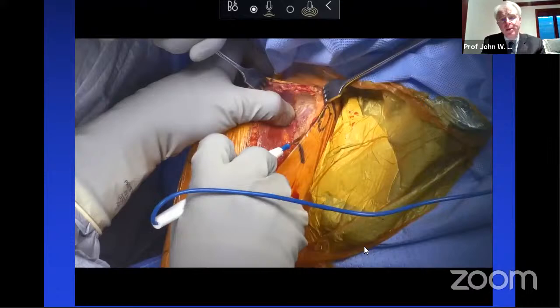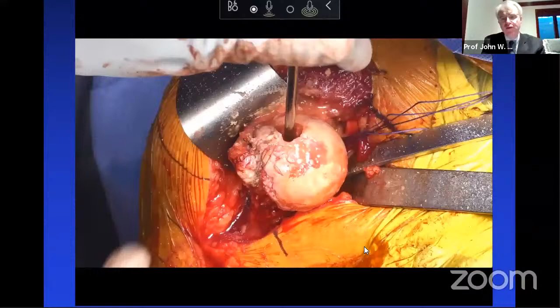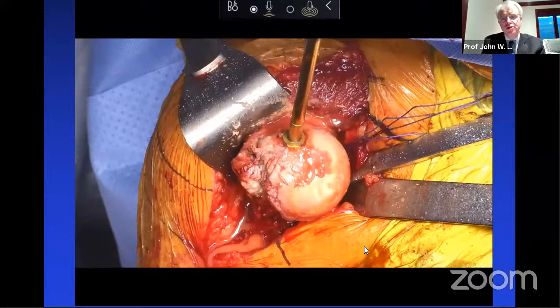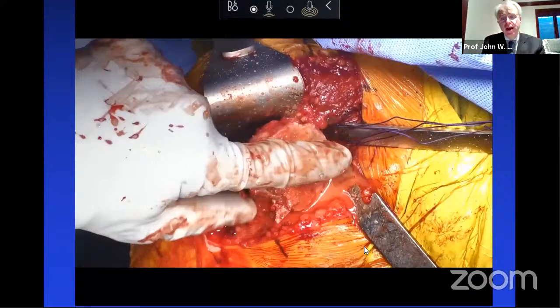We've learned we do not need to force in a tight stem. So we'll go ahead and make a generous entry hole. We'll place an ice pick in there to feel the center of the canal. And again, I'm not going to force in a tight stem. We've gone to shorter and shorter stems. I'm a simple person, hemi total reverse, cut it in 30 degrees of retroversion, as you can see here. We'll finish off our cut. We'll put a broach in there, and I like to release the capsule off the posterior aspect to the humerus.